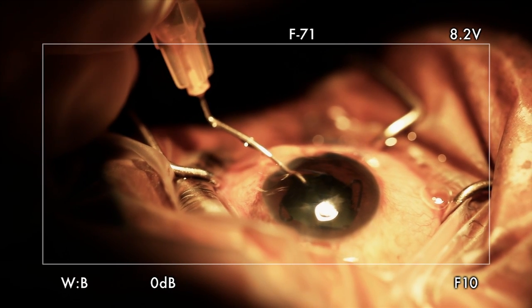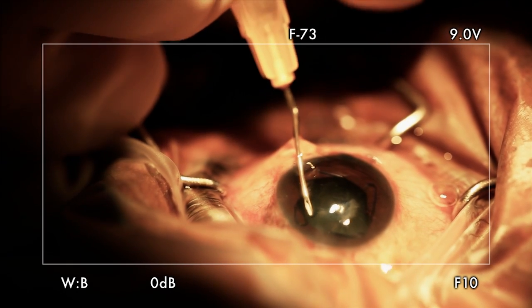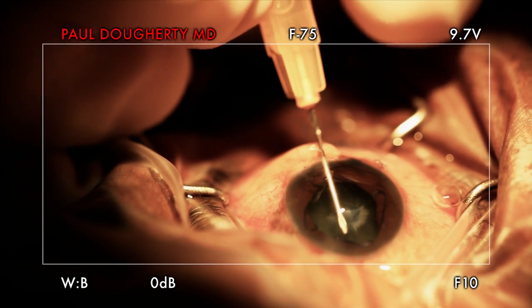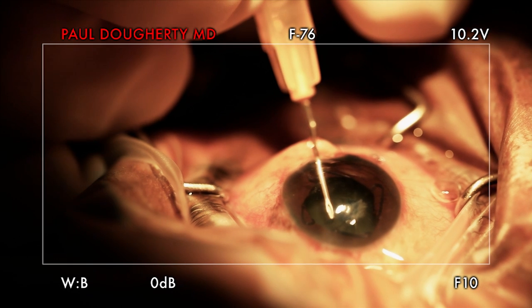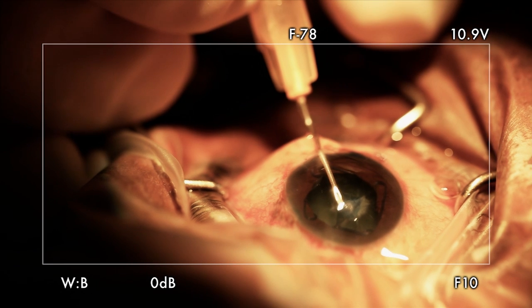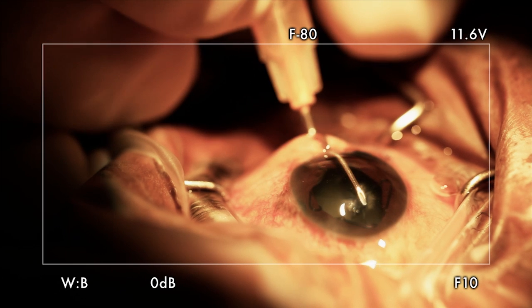This is looking at the middle of the image. It's a very fibrotic capsule. It would be really lucky to get a capsulorhexis on this because it's so fibrotic. How many more patients for the surgery? Two more... Three more. This is the thickest capsule — thick, thick, thick.